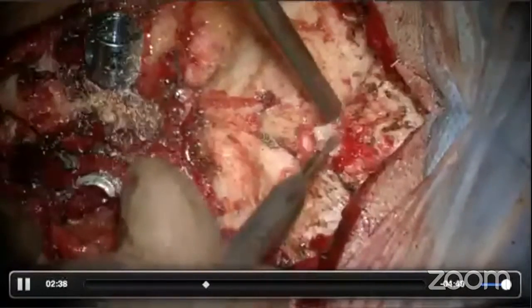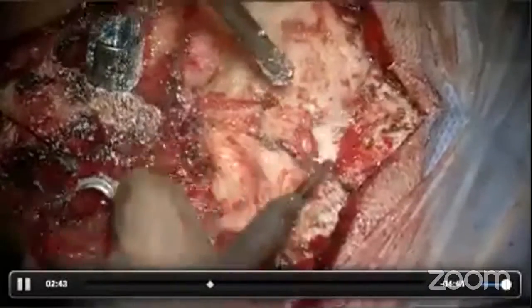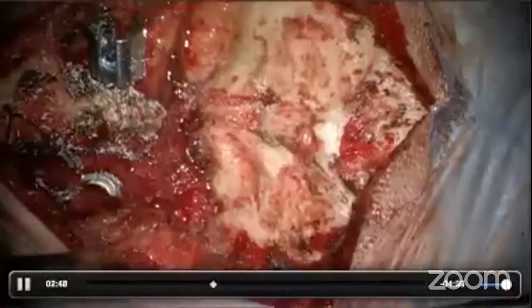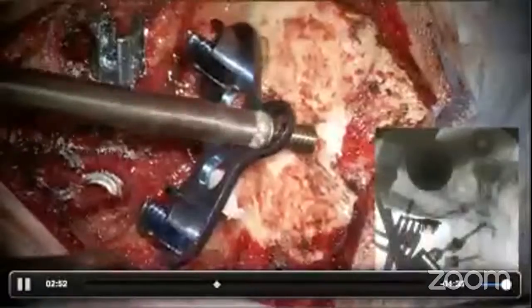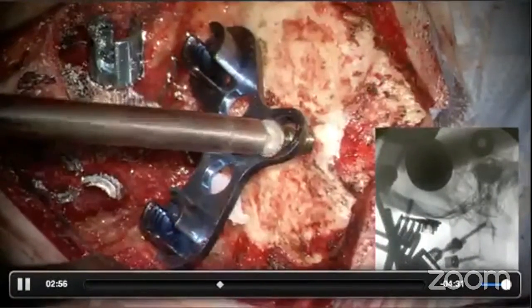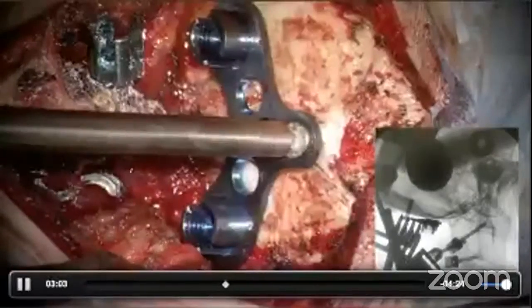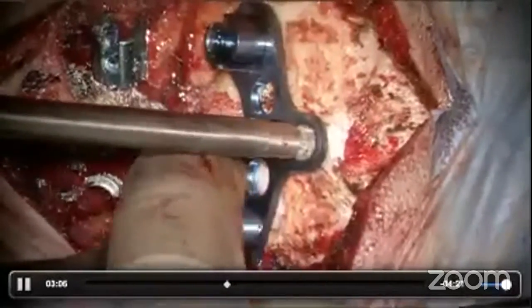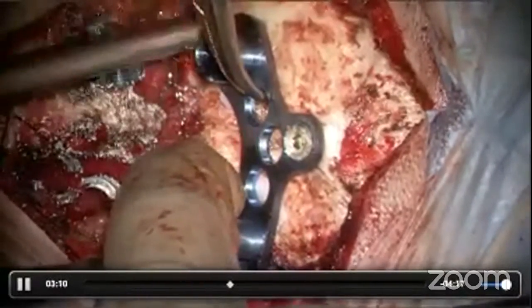Sometimes a part of the EOP needs to be drilled away to flatten the surface so that the plate can sit flush with the bone. A curvature can also be given to the plate so that it corresponds to the curvature of the occiput. Then the keel plate with the side connectors is fixed to the skull with a 2 mm occipital screw. The side connectors need some bone wax to stay with the plate, otherwise they will fall off easily while doing this. Tighten the screw such that the plate sits in the correct orientation.